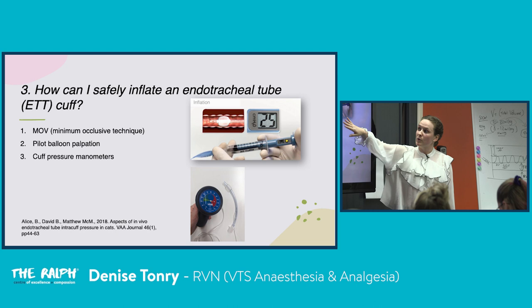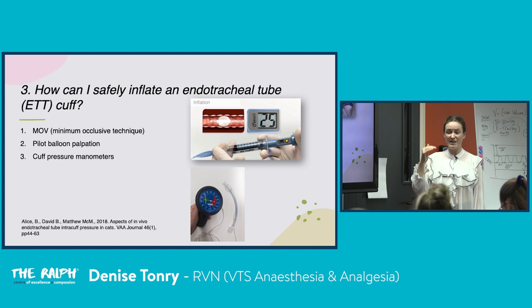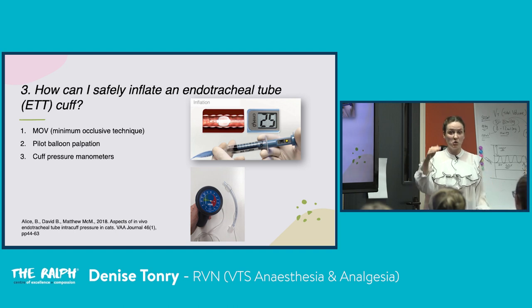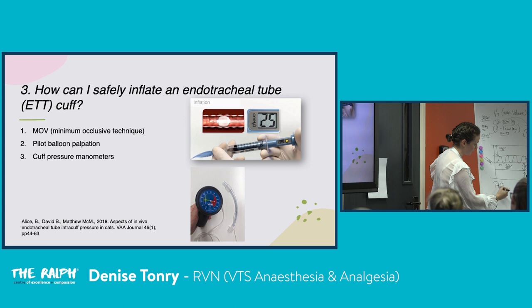One of the reasons the study gave for the minimum occlusive technique achieving these very high pressures of 56 is, when we squeeze on a bag, what pressures are we providing? Are we going up to 20? Are we providing a tidal volume of 20 mils per kilo? There's no measurement of that. Someone is closing an APL valve completely and squeezing against a taut bag. On a cat, on a dog, any patient at all, it provides high pressures. So this PIP is potentially going up to 20 centimeters of H2O.